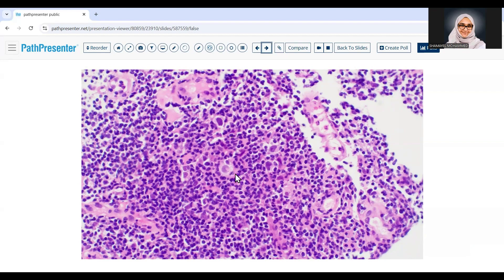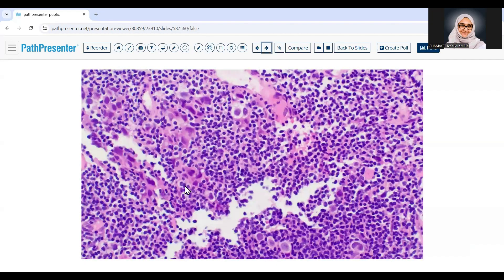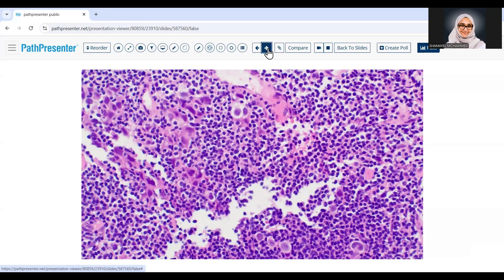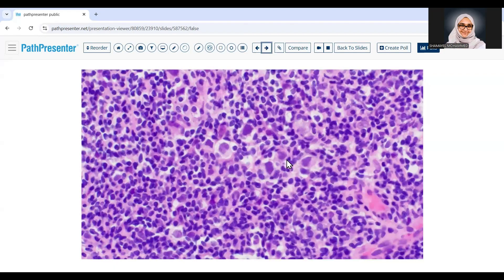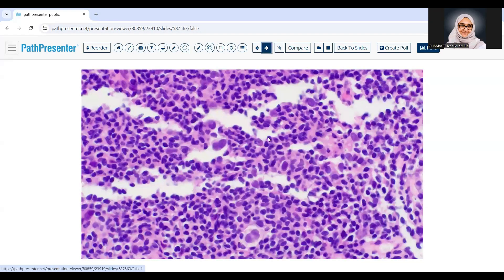As we saw in the scanned images, there are large scattered cells with prominent nucleoli. Some of them look like Reed-Sternberg-like cells with binucleation and prominent nucleoli, and they seem to be aggregating or infiltrating within the sinuses. Some look mummified or like immunoblasts — large cells with prominent nucleoli. Others are eccentrically placed, suggesting plasmablastic cells, very similar to or suggestive of Reed-Sternberg-like cells.